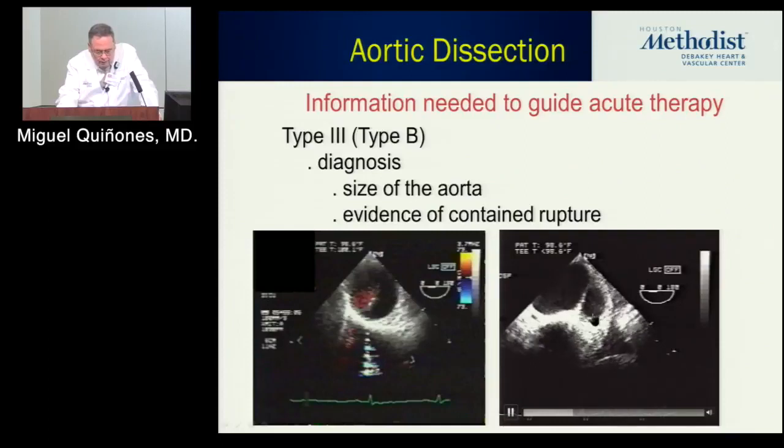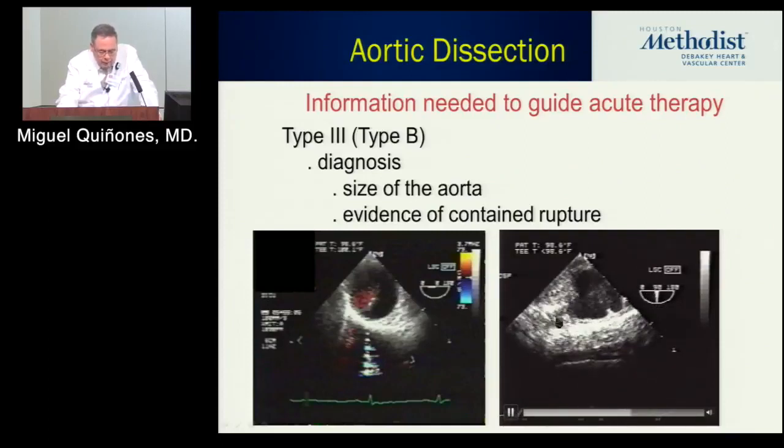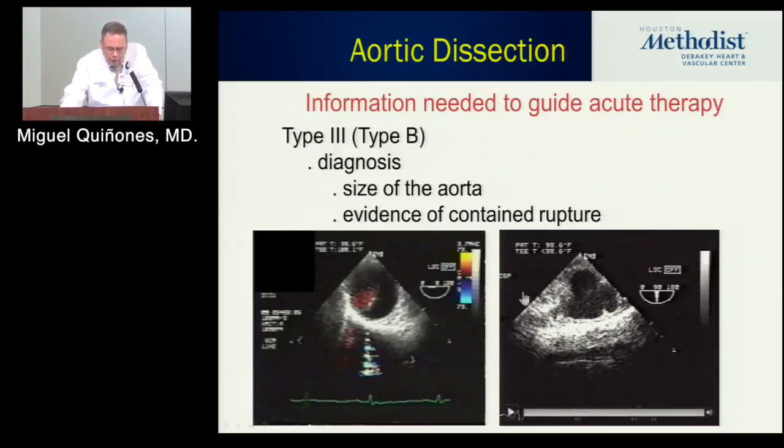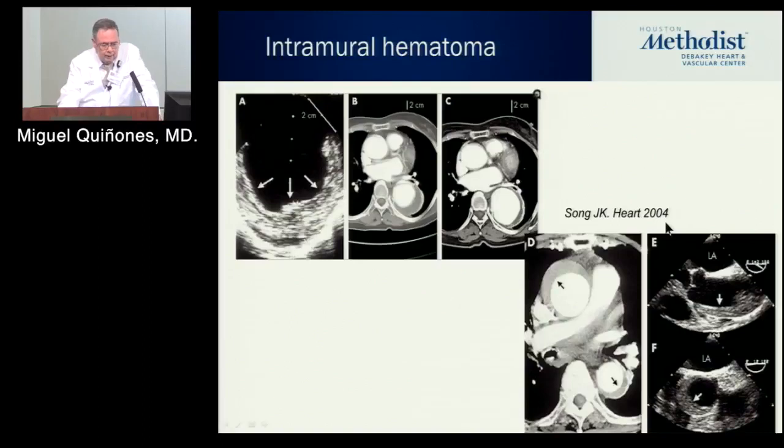There's this little thing here. And as we move, nowadays we would do an X-plane and make it even faster. You can see that all of this is basically a false aneurysm with thrombus. So true lumen, false lumen, the false lumen perforated, and the patient didn't die because there was thrombus around that formation. This is basically, at the time of admission, a patient already having a contained rupture requiring, obviously, emergent intervention.